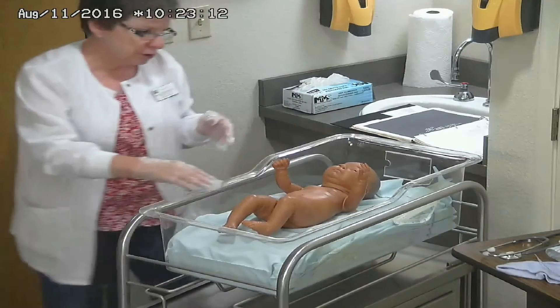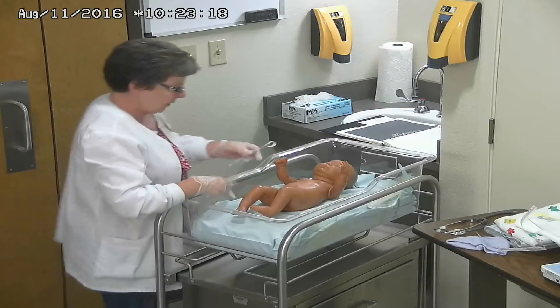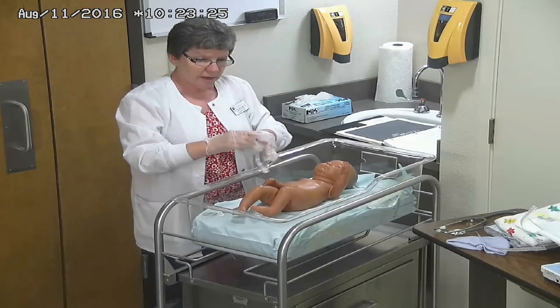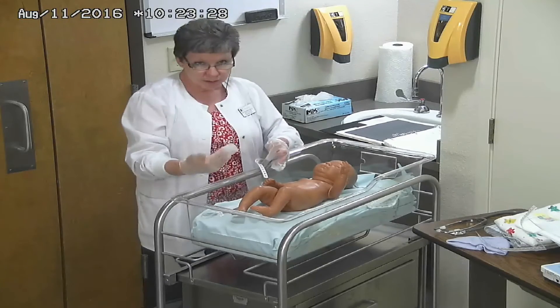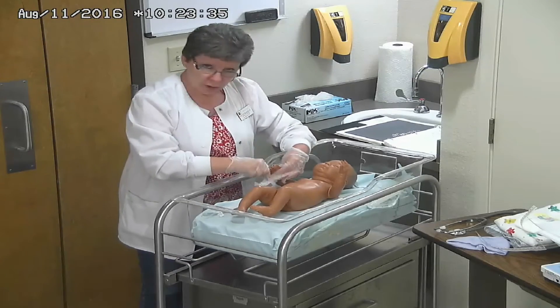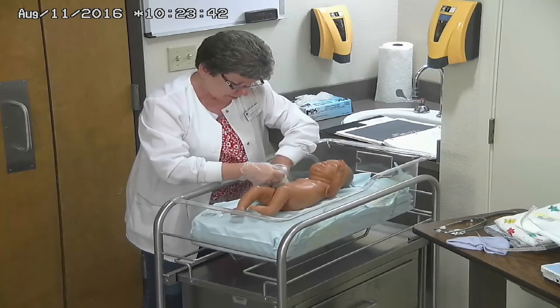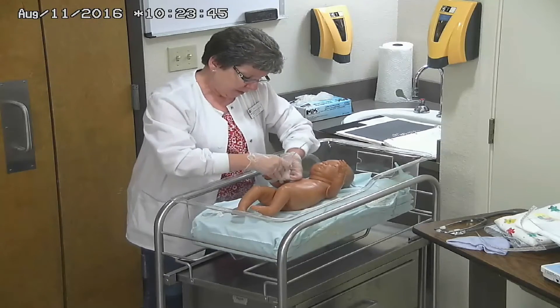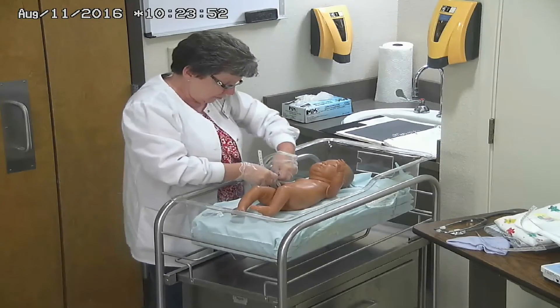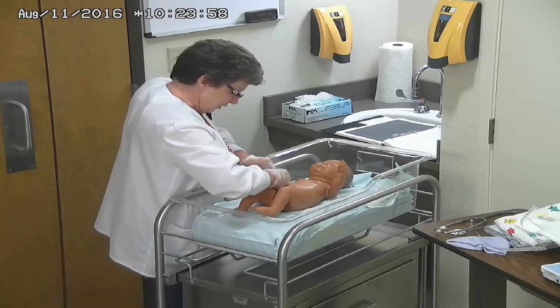So those are the main things we're going to do. We've measured the baby. Now we want to identify the baby. The baby does not leave the nursery unless there are special circumstances, such as NICU needing to manage the baby appropriately. Babies are always going to have two armbands — one on the wrist and one on the ankle — so we want to make sure we identify them correctly.